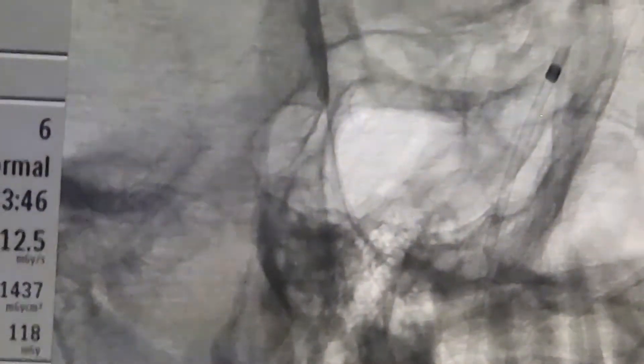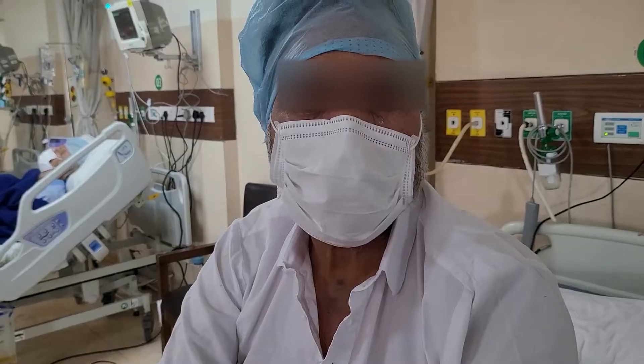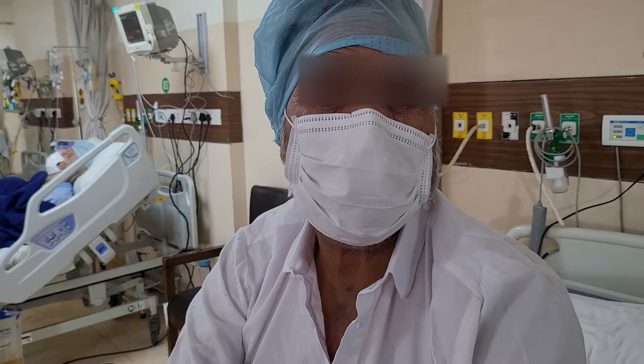Once the dilator has negotiated the whole of the stiffer segment, we remove the wire. This has to be done slowly. After that we don't push, and over the dilator we then push in the five French sheath.